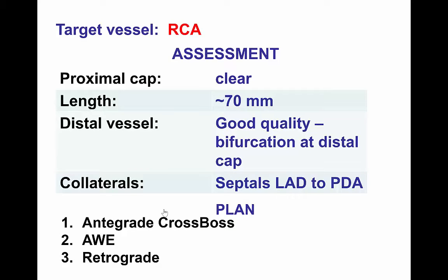The patient had a CTO of the right coronary artery with a clear proximal cap, a length of approximately 70 mm, good quality distal vessel with a bifurcation on the distal cap, and septal collaterals from the LAD to the PDA.